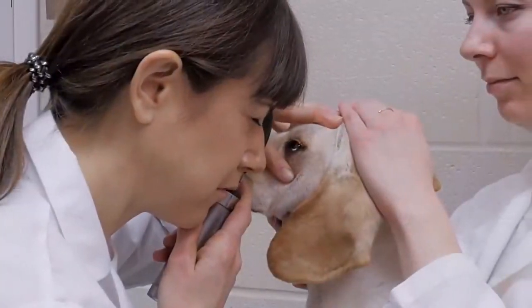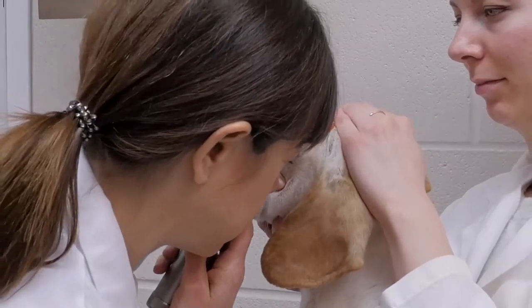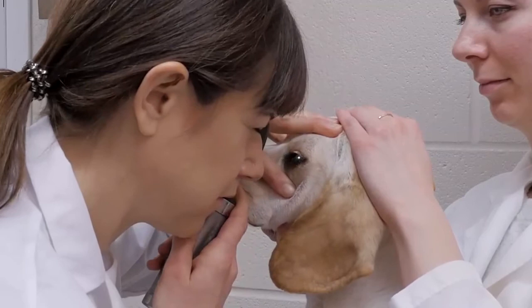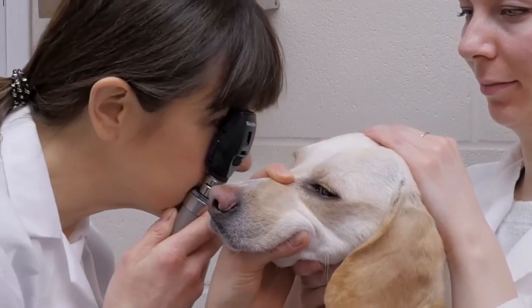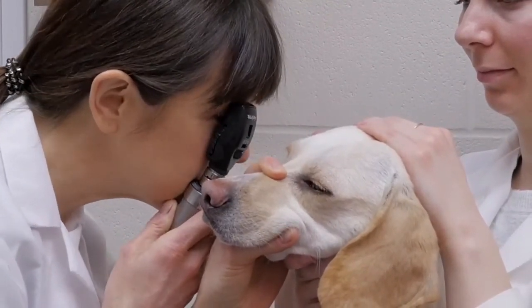Once the tapetal reflection is located, the examiner moves to a point approximately 2 to 3 centimeters away from the patient's eye to focus on the retina. To avoid interference between the patient's and examiner's noses, the examiner should use the left eye to examine the animal's left eye and the right eye to examine the animal's right eye.